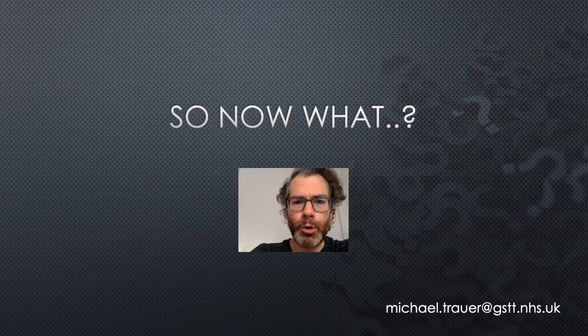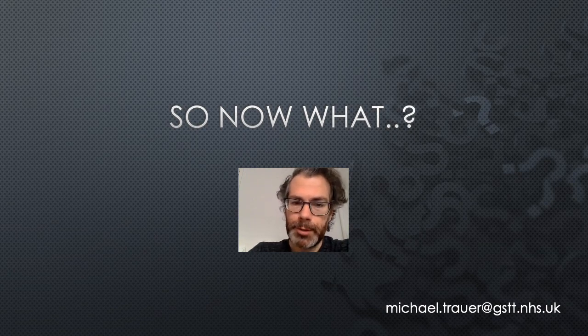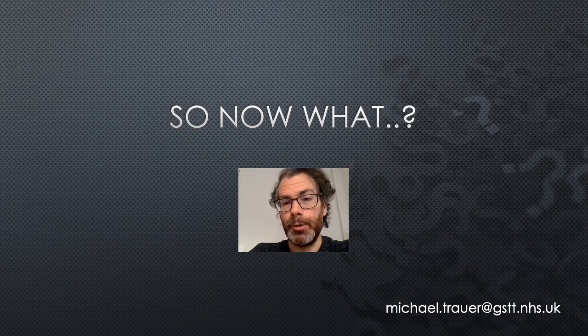Okay, so now what? Hopefully I've convinced you that there is a potential role for gallbladder point-of-care ultrasound in the emergency department. How useful it is perhaps depends somewhat on where you work and your access to formal radiology services. But I think in most places in the UK, it's very difficult to get an ultrasound out of hours. And for the two patient groups that we talked about with those cases at the start, the patient with undifferentiated upper abdominal pain, or the perhaps elderly patient with a fever of unknown source, I think in these two groups, the finding of acute cholecystitis can really change the patient's management.